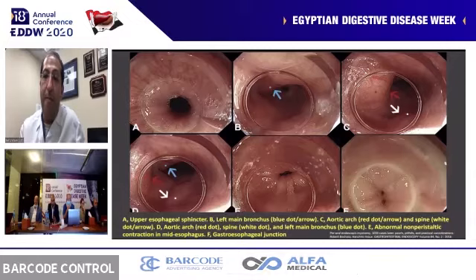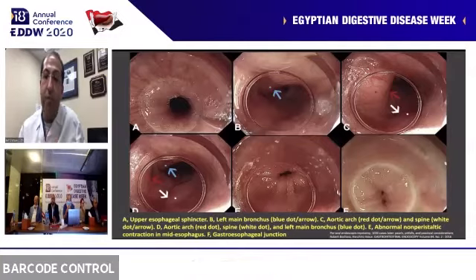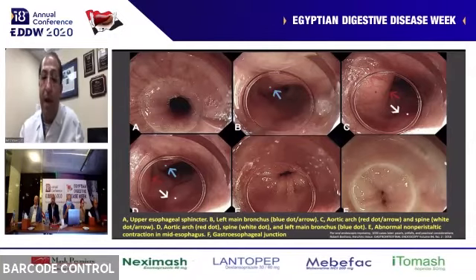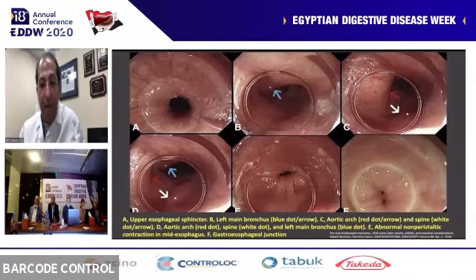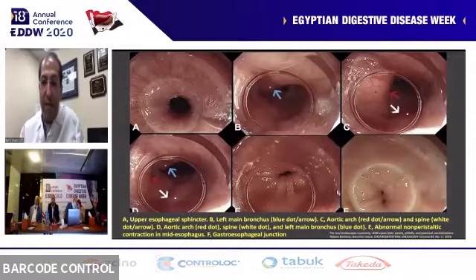You have to be mindful and aware of the aortic arch, because when you are in a submucosal space, a lot of the organs might not look the same. We're endoscopists, we're used to intraluminal endoscopy. We're very familiar with intraluminal landmarks, but we're not so familiar with extraluminal landmarks. That's why we have to be very careful. You stay to the plane, as I showed in my diagram of the layout, either 1 to 2 o'clock for the anterior approach or 5 to 6 o'clock in the posterior approach.